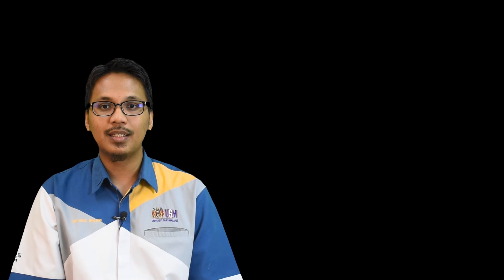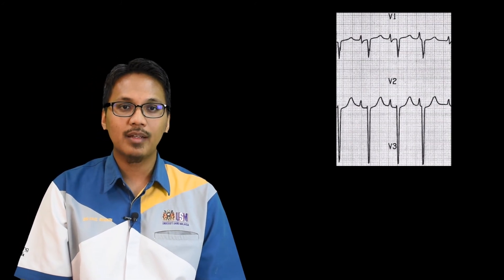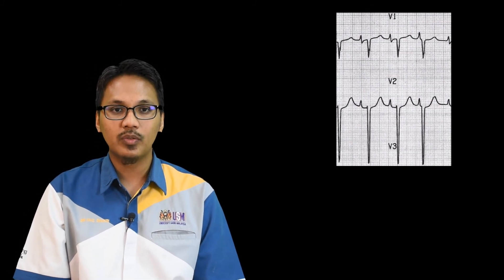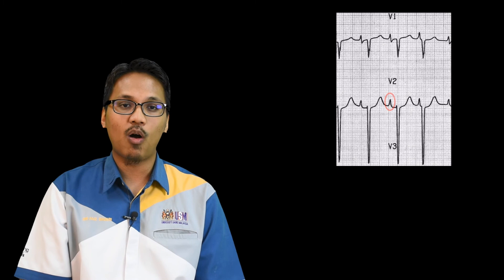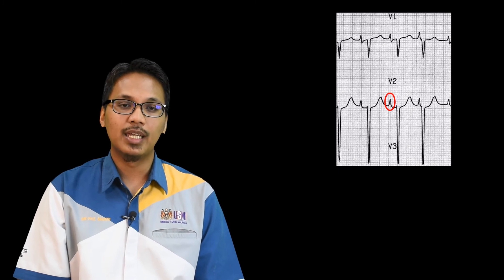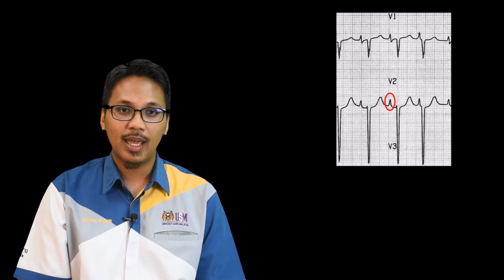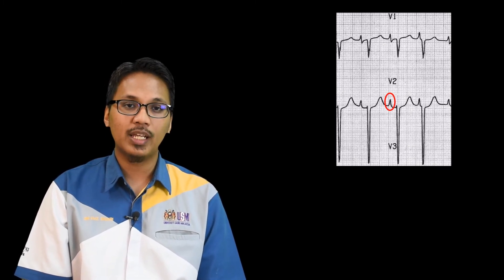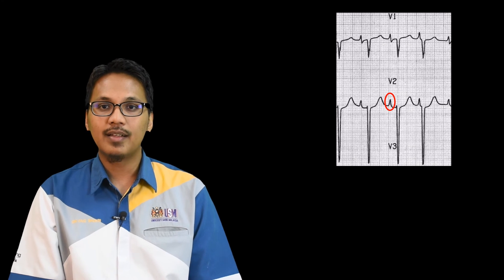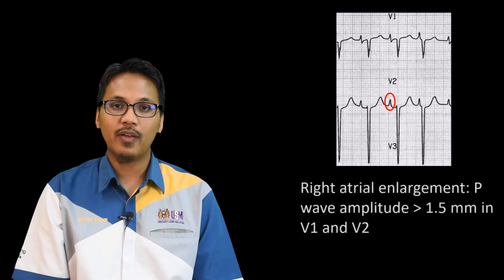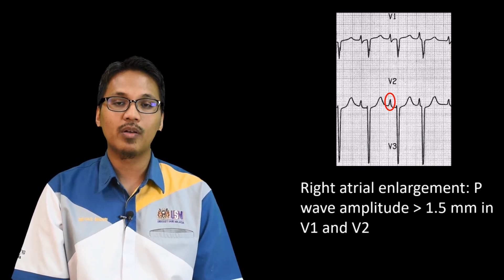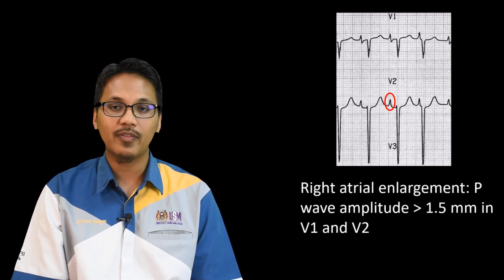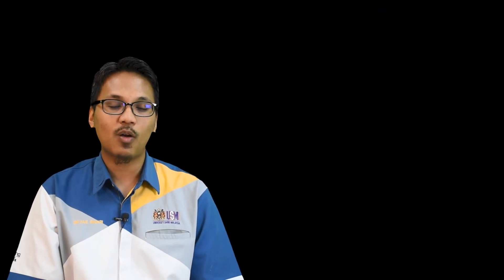This is our second example — you can see from leads V1 and V2, especially particularly obvious in lead V2 as shown in the red circle, there is a P-wave with amplitude of more than 1.5 mm. That concludes our third special condition ECG, which is P-Pulmonale.